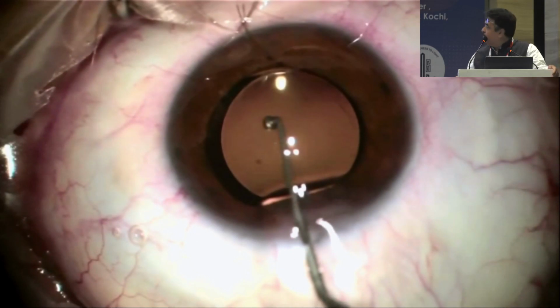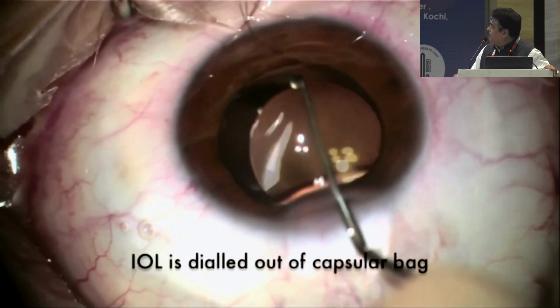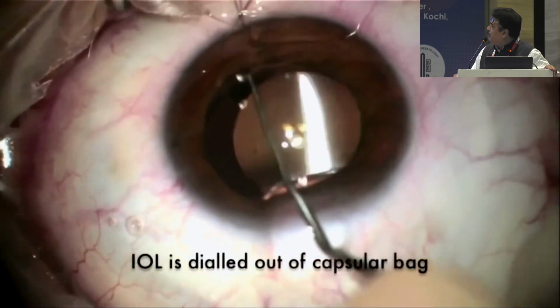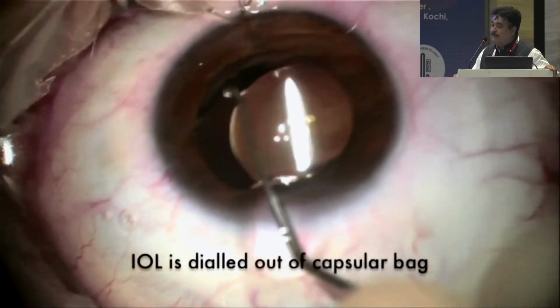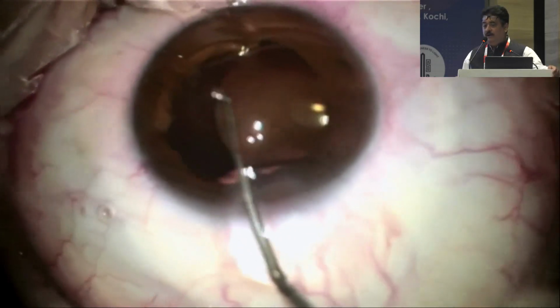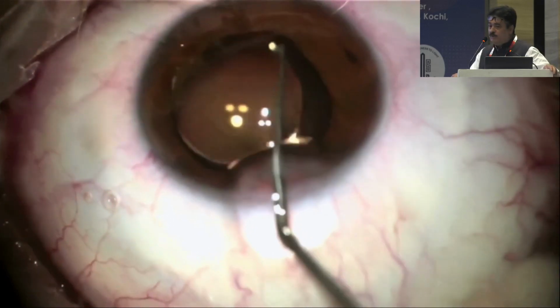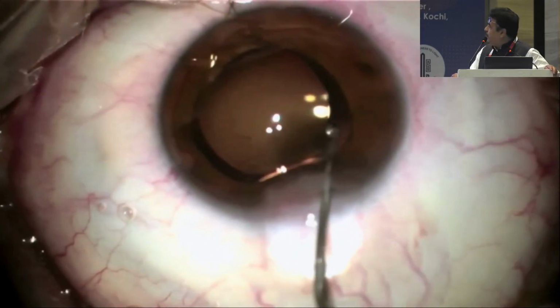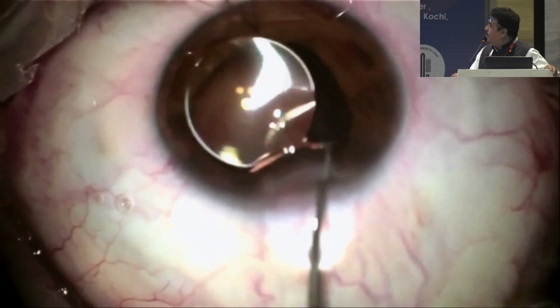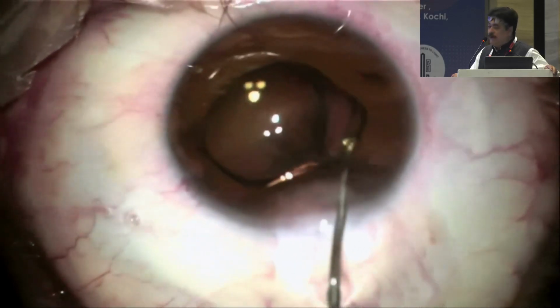So the thing is this, how can we explant? This is a simple technique. Because the IOL was implanted recently, we can dislocate it easily outside the bag. But we have to take care of 2 things only, the posterior capsule and the cornea. So we have to inject a lot of viscoelastic during the surgery and should not allow the chamber to collapse at any time. It was recently operated, so we could easily explant it into the anterior chamber.